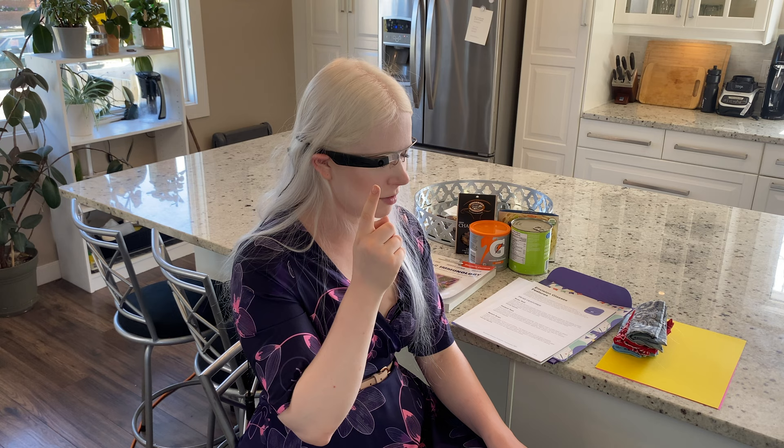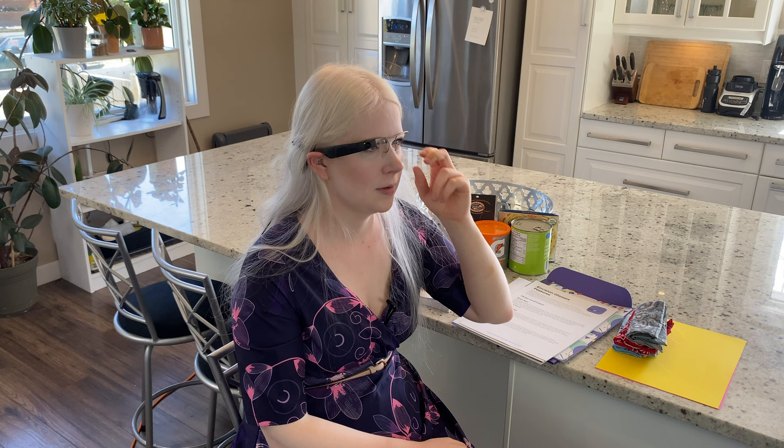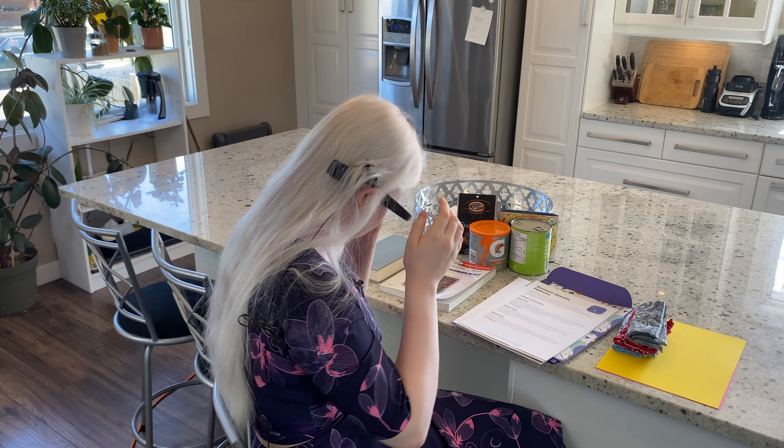Explore — if we go into explore, it's going to try and identify objects it recognizes: table, oven. I think this one's very much still in beta. Describe scene — let's do a describe scene. I'll be facing into my kitchen. It just took a picture. A kitchen with a stove and a microwave. There's no microwave over there, but there is a stove. So that's pretty good.